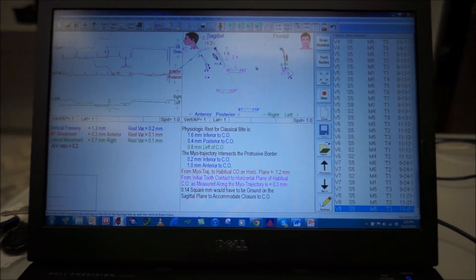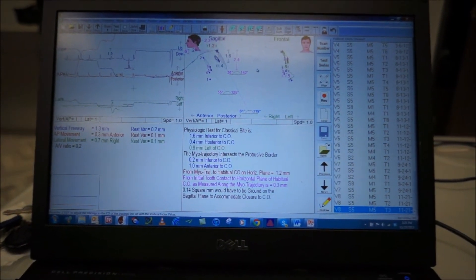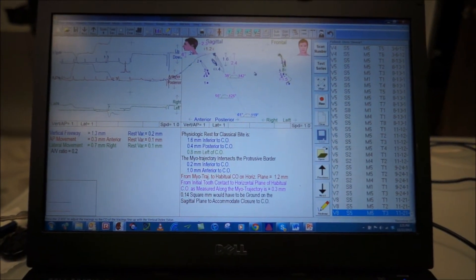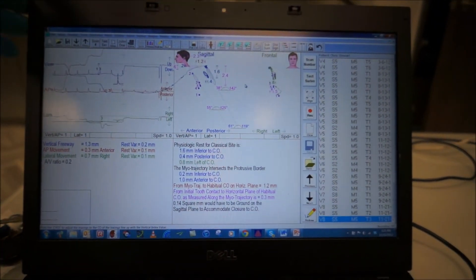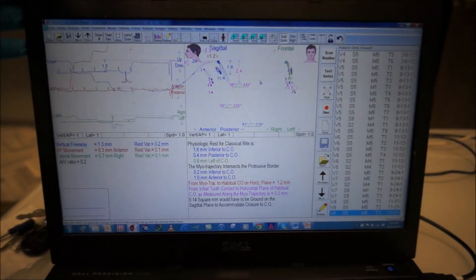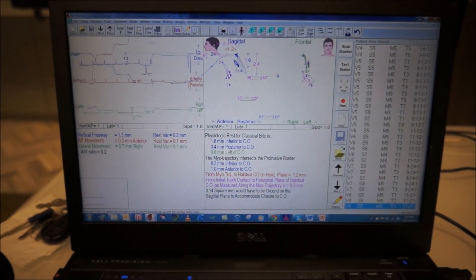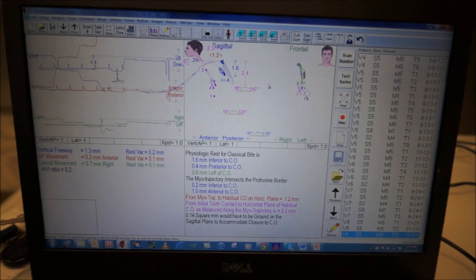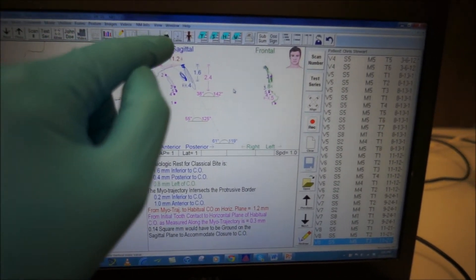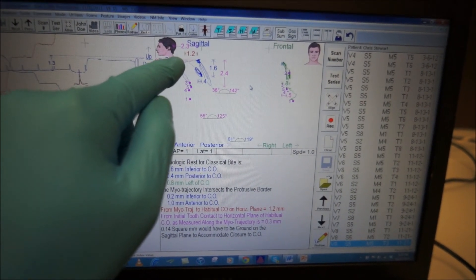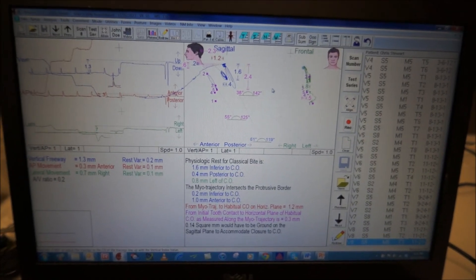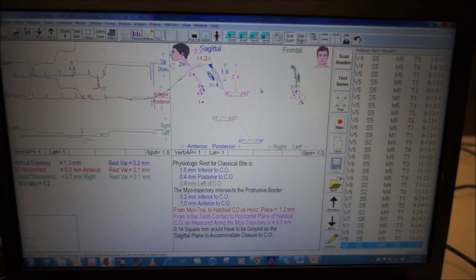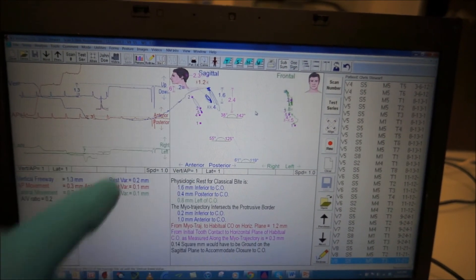So this is critical to us as dentists to find the proper bite position so we don't have to be guessing locations. And this is down right down into tenths of a millimeter, so we're looking at something very small, although it looks large on the screen.